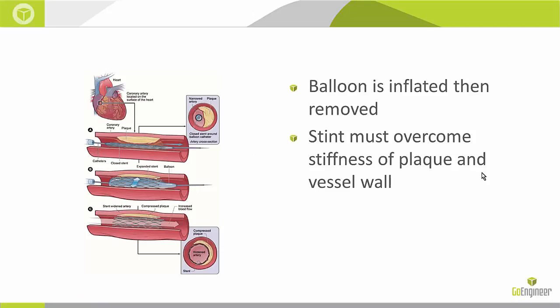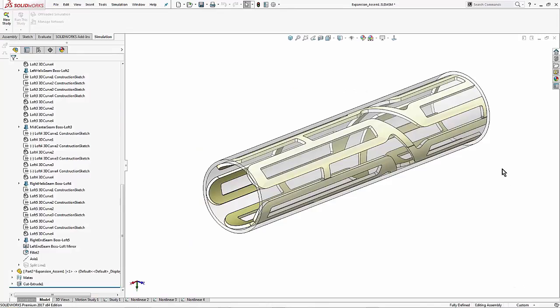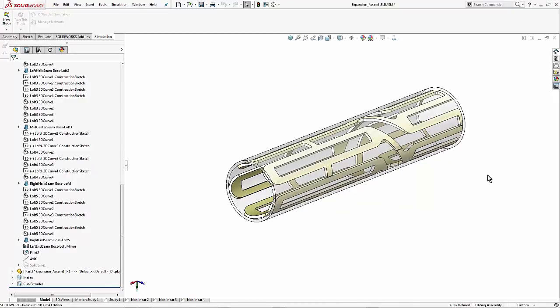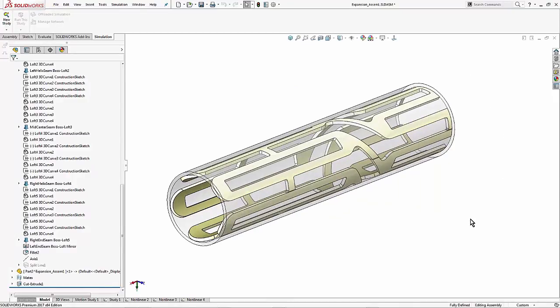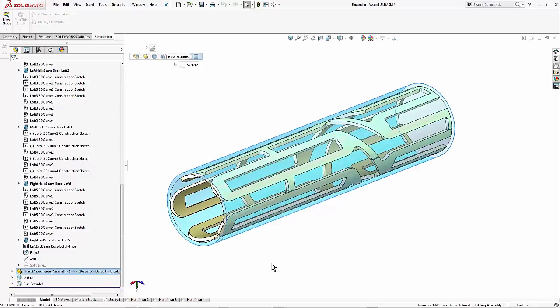Now a Nitinol stent is used basically like this. It's pushed into a blood vessel with a balloon in the center. The balloon is inflated and then removed leaving the stent in place. If I was going to analyze this in SOLIDWORKS simulation I would also need to know the stiffness of the compressed plaque and the blood vessel itself. So for the first analysis we're going to run, let's set this up taking that assumption.